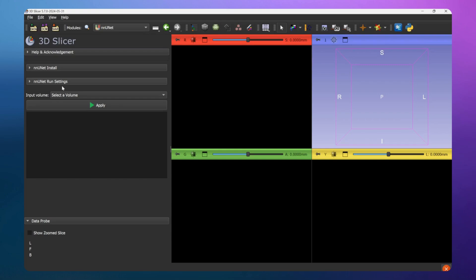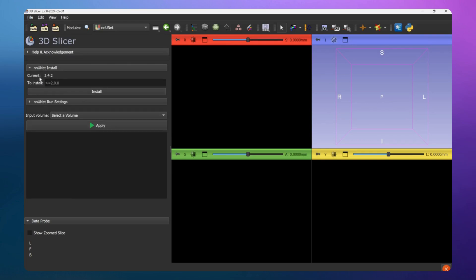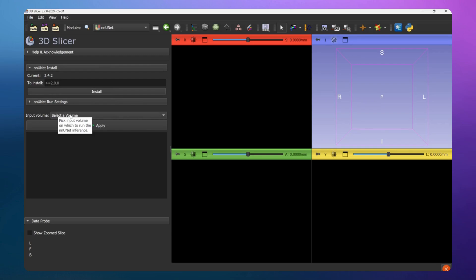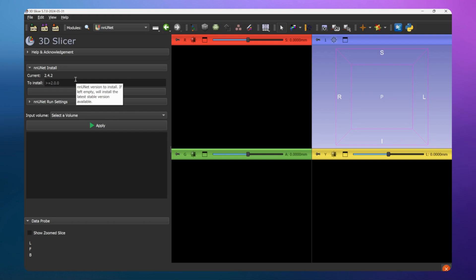Go to the NNUnet Install tab. For me it is already installed, but the first time you open the extension you need to click Install. You only do this once. After that, you don't need to do it again unless you want to upgrade to a new version. Just click the Install button and it will install PyTorch, NNUnet, and all the dependencies needed to run inference on your model.